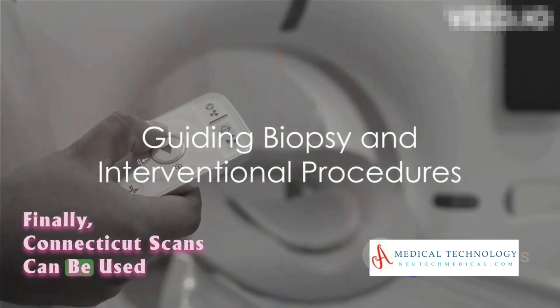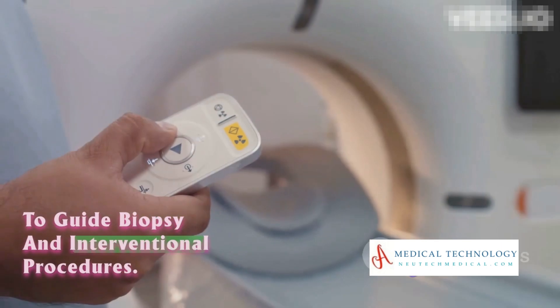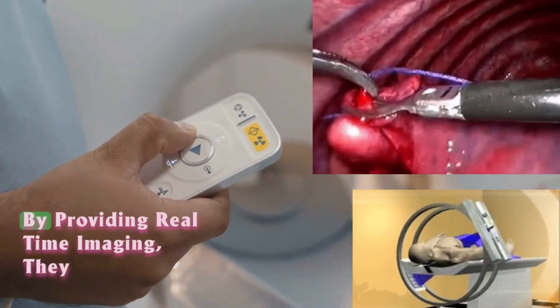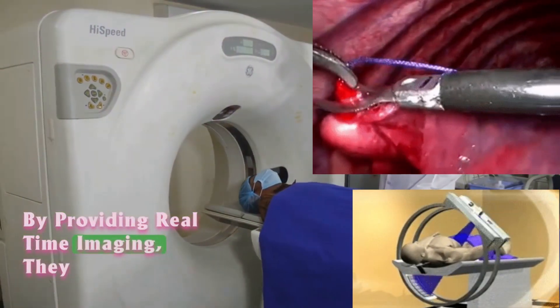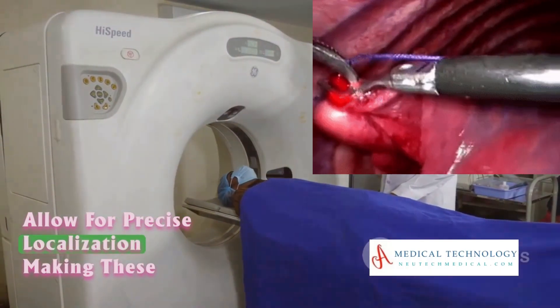Finally, CT scans can be used to guide biopsy and interventional procedures. By providing real-time imaging, they allow for precise localization, making these procedures safer and more effective.